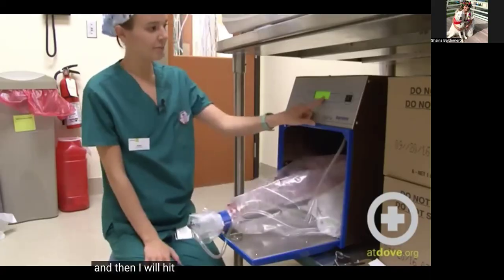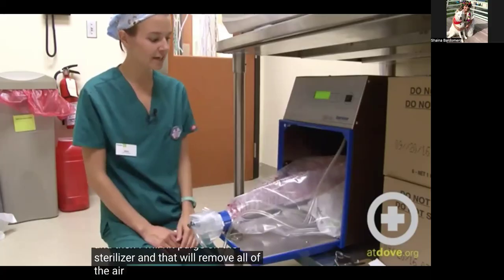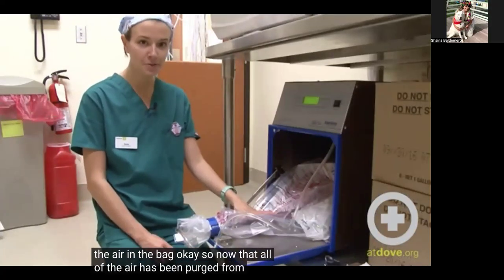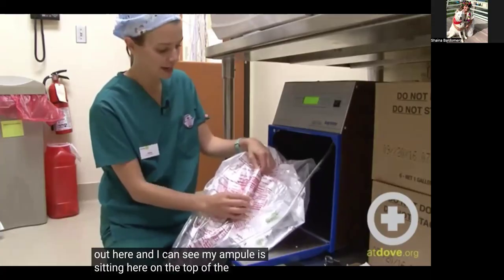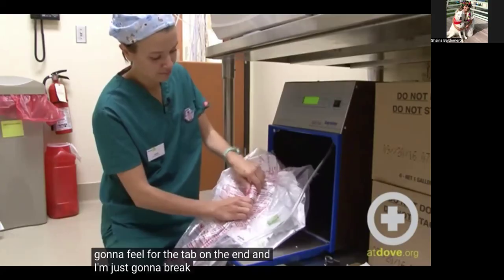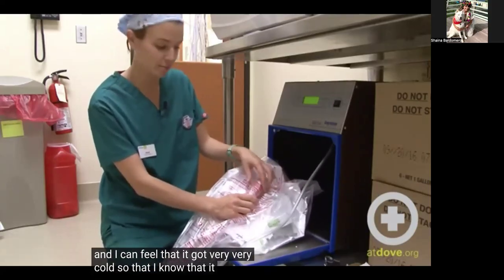And then I will hit purge on the sterilizer, and that will remove all of the air in the bag. Okay, so now that all of the air has been purged from the bag, I'll bring the bag out here, and I can see my ampule is sitting on the top of the bag. I'm going to feel for the tab on the end, and I'm just going to break it just like that, and I can feel that it got very, very cold so that I know that it broke.